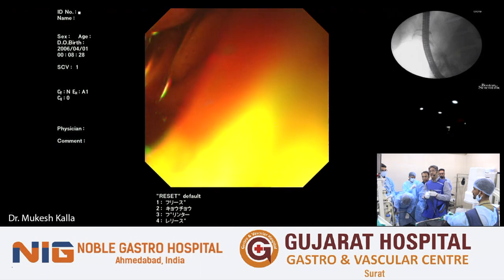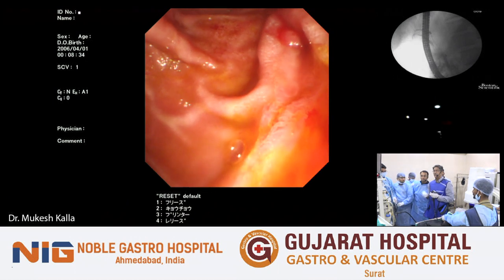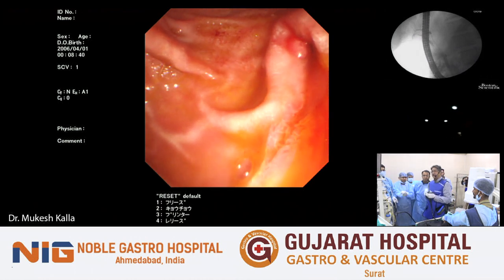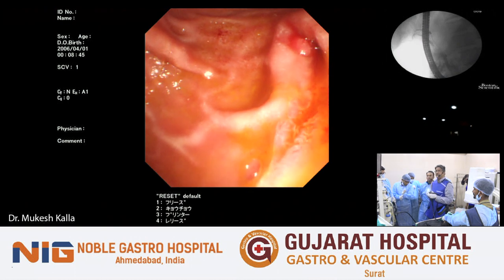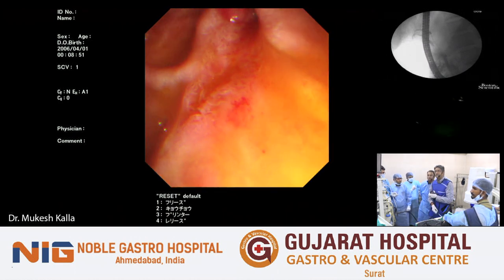So I don't know, for the last 4 or 5 years, since 2017, I'm in the habit of using my assistant for the cholangioscopy, which gives me liberty. I think it's also a good idea. Yeah, because it gives me liberty. I keep the laser pedal in my hand. I keep the irrigation pedal in my hand. So, there's less multitasking while the procedure is being done.